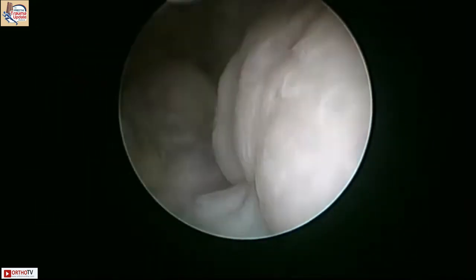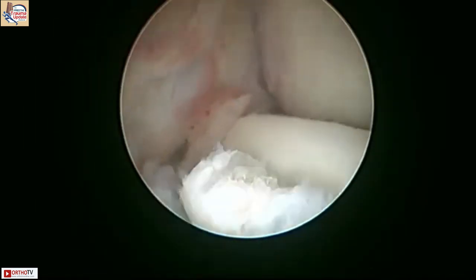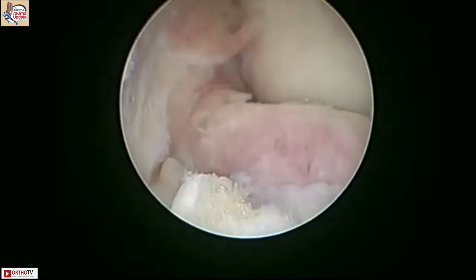Yeah, and so when you flex, you can see the osteophyte. So that is the osteophyte. The entire red thing is the osteophyte. That is your radial head. It has some degree of cartilage and loss of cartilage.